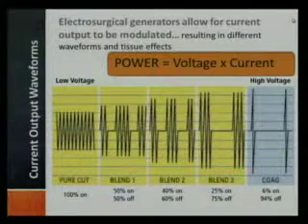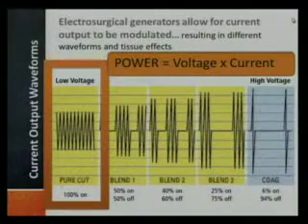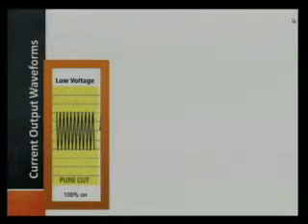Let's first talk about pure cut. Cutting current doesn't mean it produces a cutting action. Just because that's what it's named, it's really a misnomer and kind of unfortunate that we call one cut and one coag.